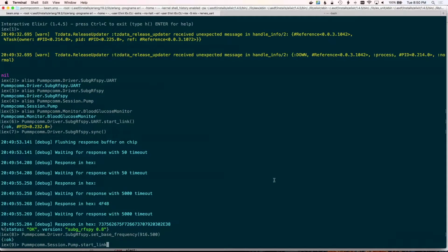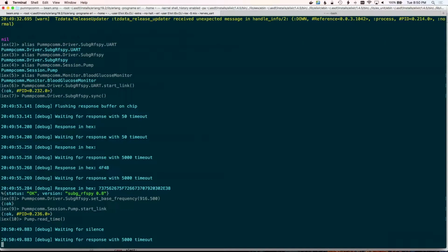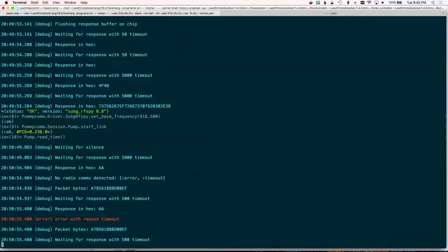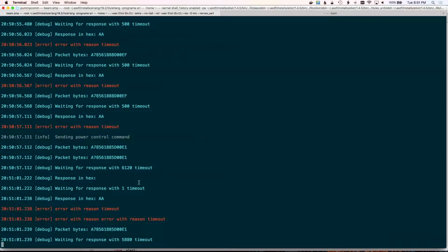So I'm going to go ahead and start up the pump gen server now. And we're just going to see what happens here. All right, so it's waiting for silence. It's going to give it 5 seconds, and if it doesn't hear anything else going on, then it's going to try to wake the pump up. So these timeouts mean, hey, your insulin pump is asleep. And now it's going to turn around and try to wake it up.